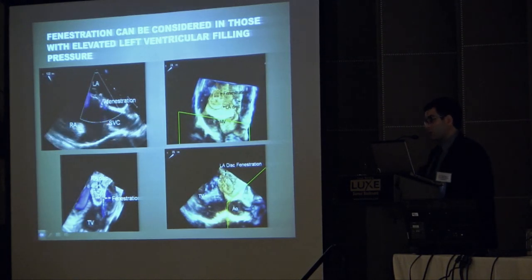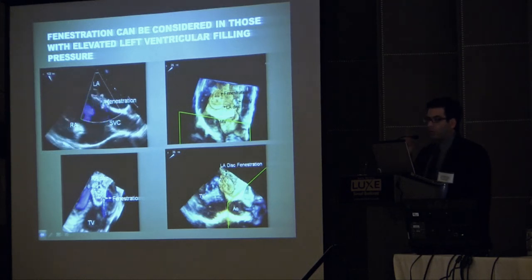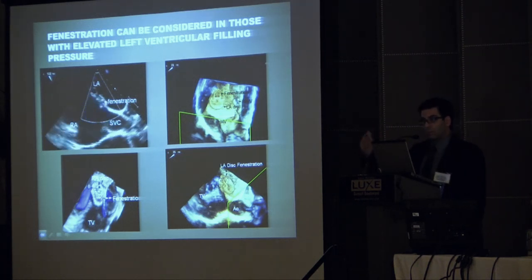QP to QS ratio. So certainly legitimate to try to close the atrial septal defect, but one of the worries here is that if you close this atrial septal defect in somebody with a very non-compliant left ventricle, which an octogenarian with all those risk factors would have, and he's a veteran and smoked in addition to that, and had coronary disease, you have to really think about what's going to happen to that left ventricular filling pressure when you take away this pop-off.